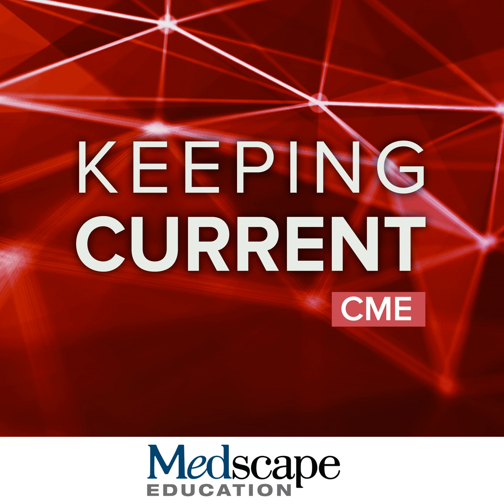Now we'll go through those relevant imaging protocols. So for the AD therapy enrollment exam, again, that is recommended to be one and the same as the dementia evaluation to prevent the need for repeat imaging between the times of diagnosis and therapy enrollment assessment. For the AD therapy monitoring exam, again, an MRI brain without contrast. In some practices, that is being done using an abbreviated protocol of just those three key sequences of the FLAIR, GRE, and DWI in order to help accommodate increased MR scan volumes.